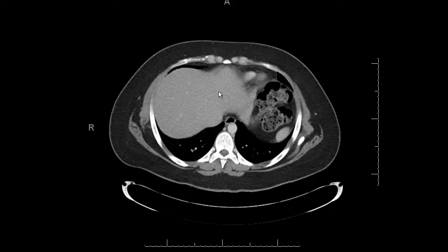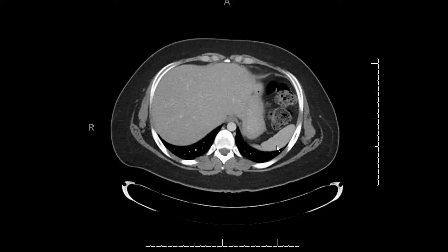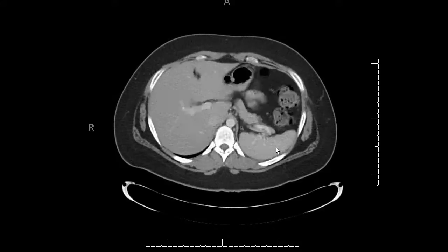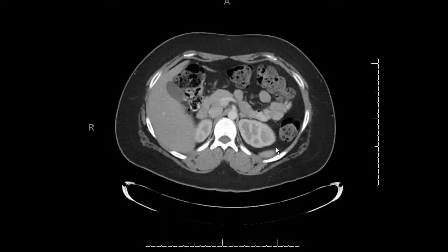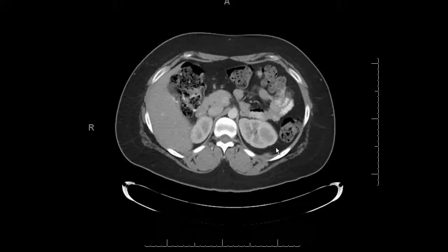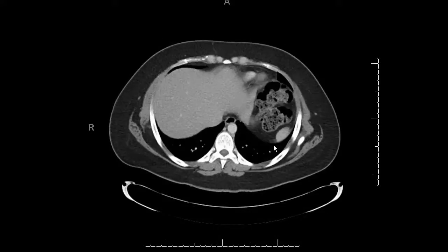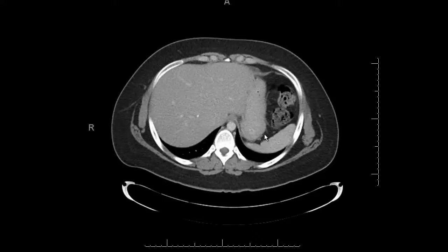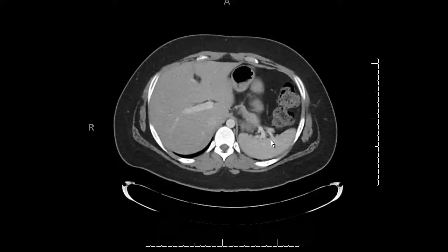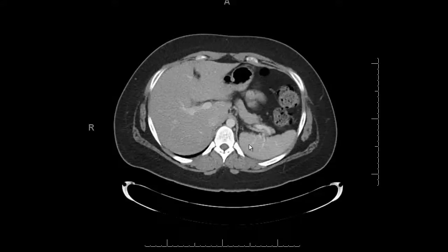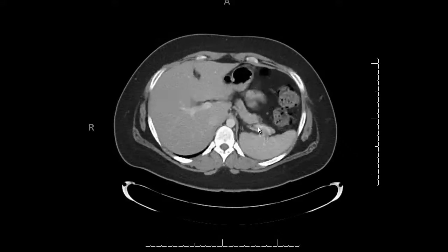Then I look at the spleen and scroll through it. There's usually not much going on with the spleen, but pay attention whenever you're looking at organs to the fat surrounding the organ — it should be nice dark fat. You shouldn't see stranding or fluid. If you do, look extra hard at the organ parenchyma because there may be a lesion.